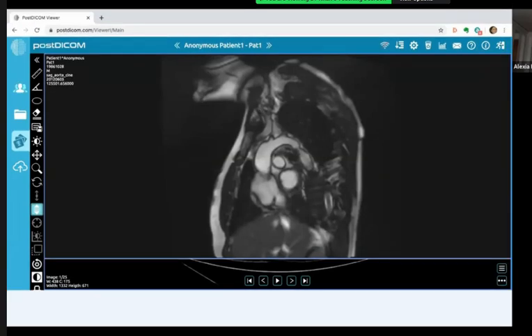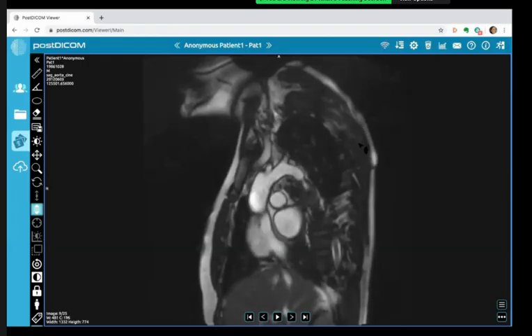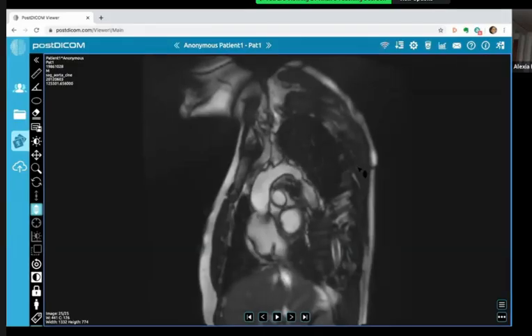Okay. So this patient had an MRI. Focus on the aorta, so follow it from its origin, across the arch and down, descending thoracic aorta. And I'm going to play the cine images for this patient. Ignore everything else, and look at the aorta. And this patient is a young hypertensive, 33 years old. Do you think you have seen an abnormality?